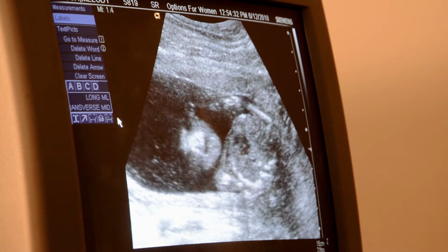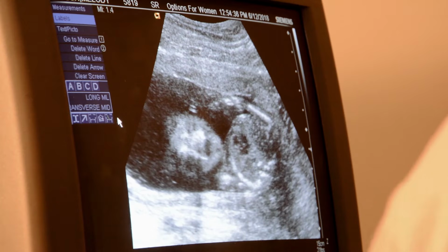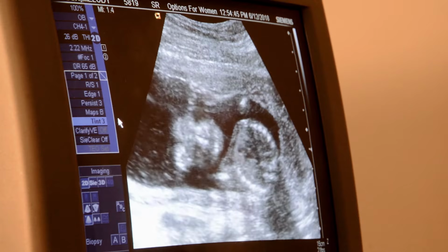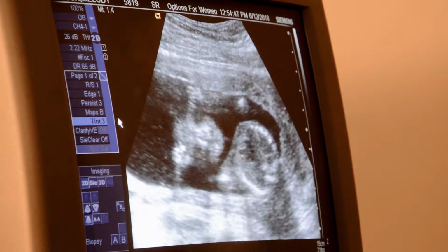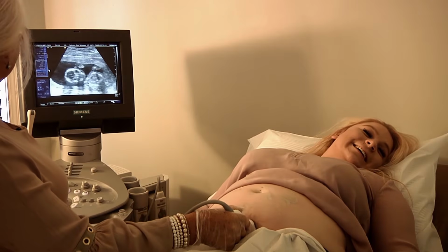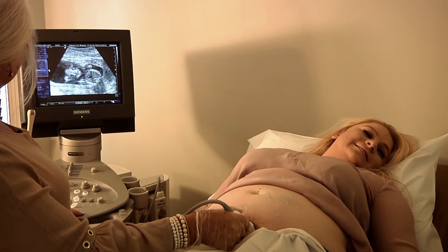You like that? It's talking already, Mom. Oh my goodness. Oh. All right. So, anyways, when I see a cute baby, I just take the cute pictures. And look at him wave. Still going, huh? Yes, going. Oh, he is so cute.